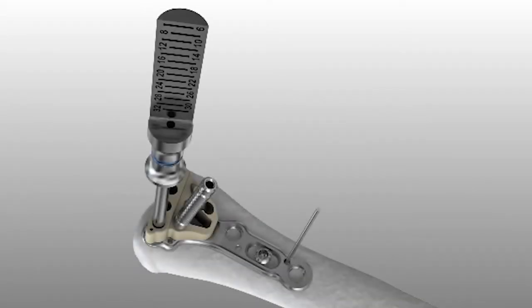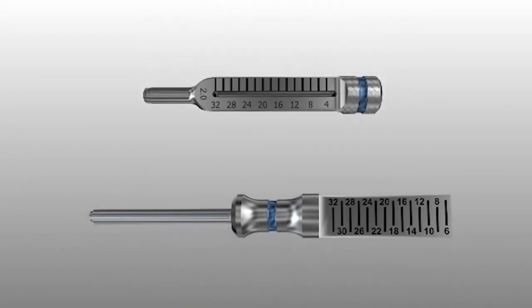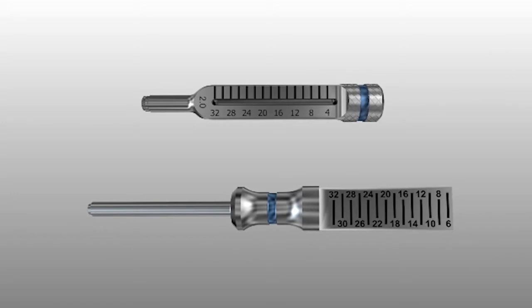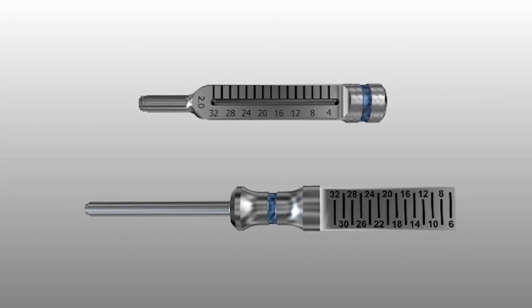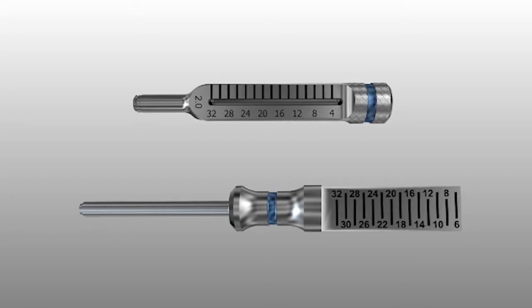Insert the drill guide into one of the distal screw holes, followed by the 2.0 mm drill. Screw length is measured by using the laser mark on the drill or depth probe against the scale on the drill guide. Individual locking drill guides are also available in the system as an alternative for drilling and measuring the distal screw holes. Screw length can be read off of the laser line on the drill or probe with a locking drill guide as well.